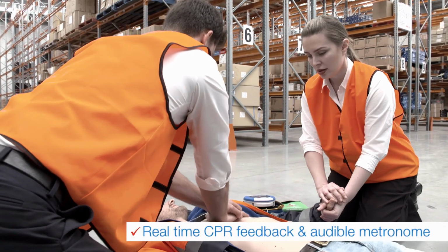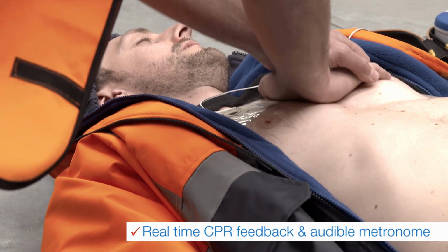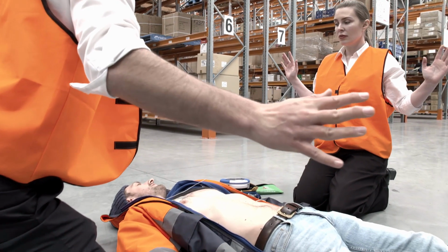Begin CPR. Push slower. Good compressions. Stop CPR. Move back. Assessing heart rhythm. Do not touch the patient.